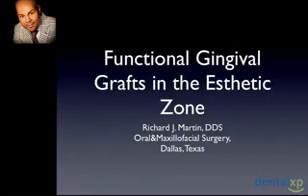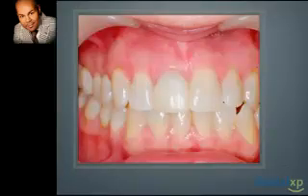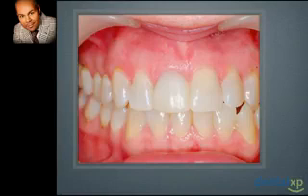It is well known that anterior dental implants should be placed towards the palate in the maxilla, leaving a gap between the implant interface and the buccal plate. This is done in order to prevent pressure necrosis and resorption of the plate. Whether or not the gap is grafted with bone depends upon the practitioner's choice and associated distance. However, it is well known that soft tissue support of the area is needed. Various bone and soft tissue grafting methods have been used and are well documented in the literature.